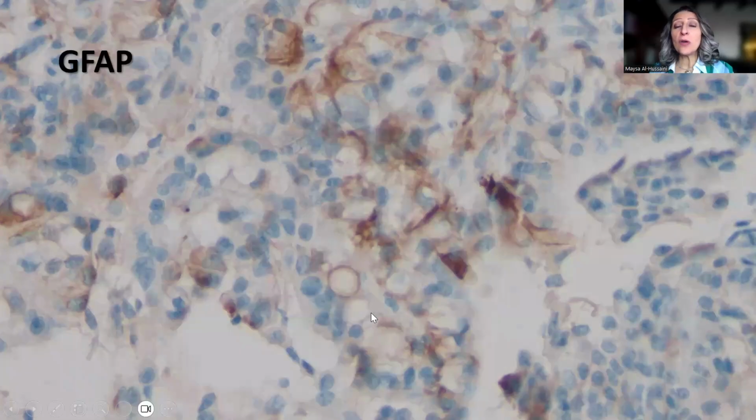Now, GFAP was focally positive in some of the tumor cells, not really widespread positivity. Unfortunately, at the time, we did not have transthyretin, which usually shows cytoplasmic or even sometimes apical positivity, which would support the diagnosis of choroid plexus tumors in general.